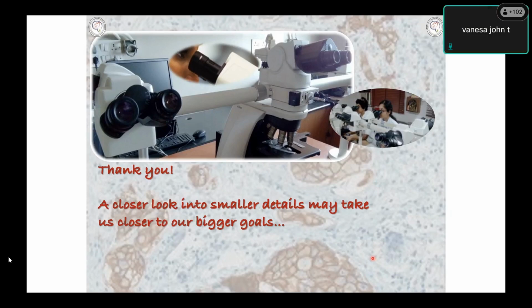Thank you so much, madam. There is one more question. Where to look for the organisms in the biopsies given?